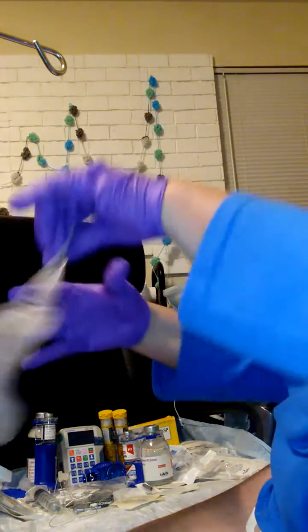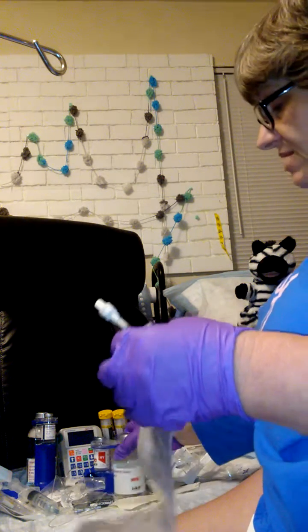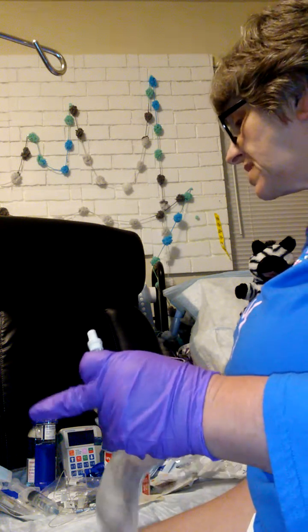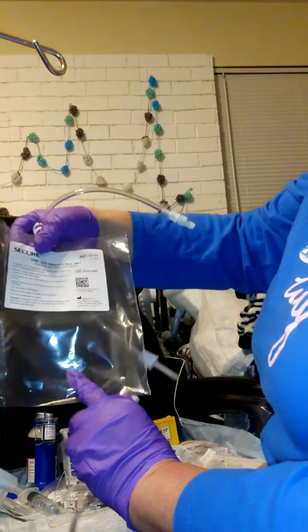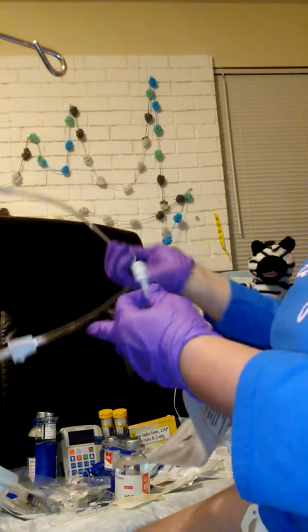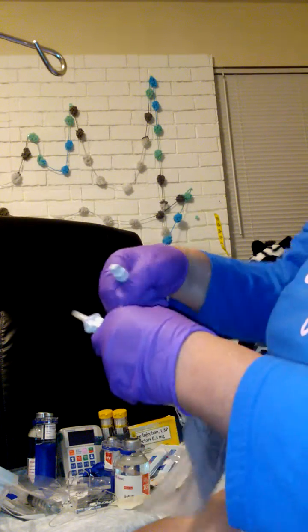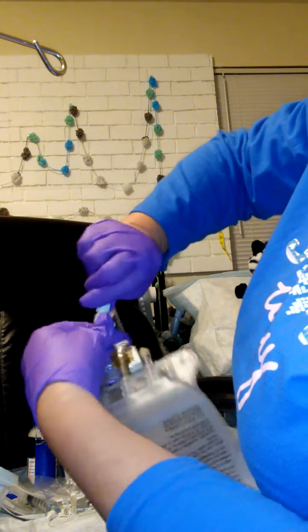I'm going to lay it right here and get this bag out. This is the bag that all of the big bottles are going to go into. So I take my big bottles and have them cleaned. We already did that. But I also need to pull out this gravity bag, gravity fill set, and this piece gets attached here. Take that one off and this one off. And it's a male and female set, and you just join them right here.